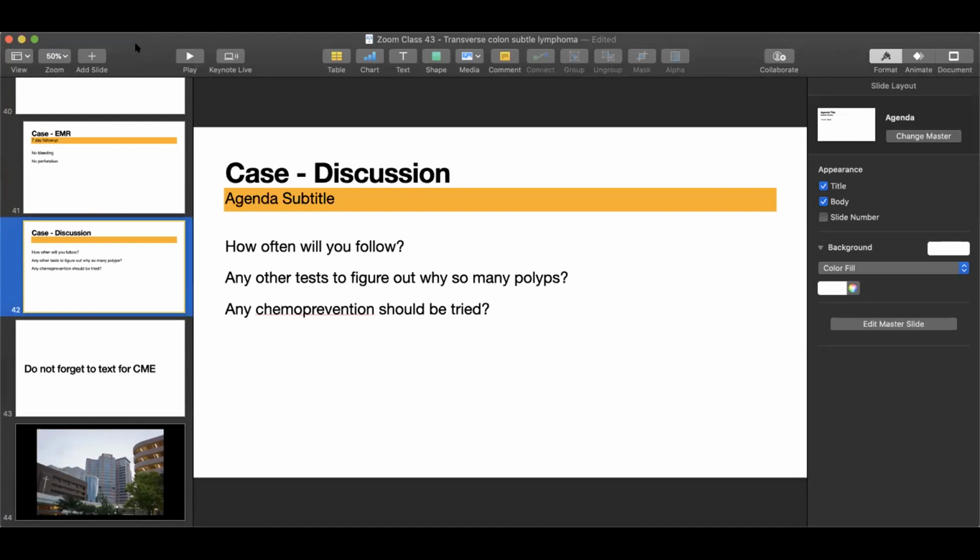Yes, sir. Beautiful case, and I can't think of anything different. But one idea I have is that because these are flat polyps requiring multiple injections and resection, it may become easier for the proceduralist to use a snare with a combination of injection and snare, so that you don't have to change instruments too often. There are a couple of those snares available out there.